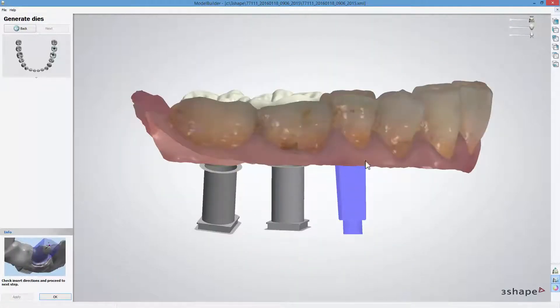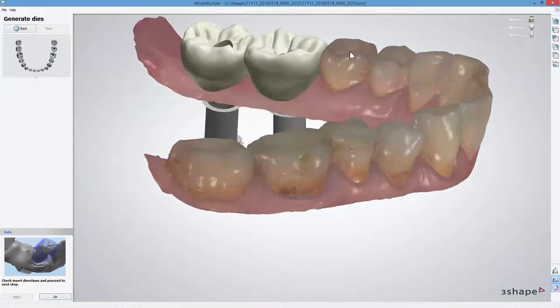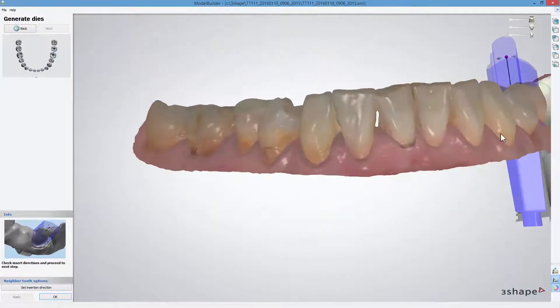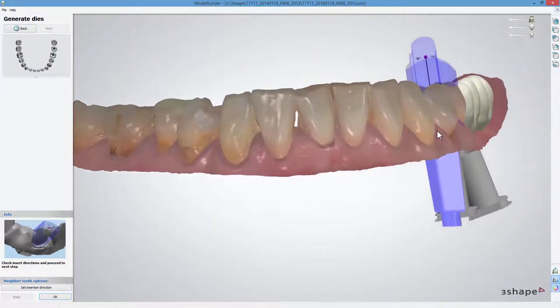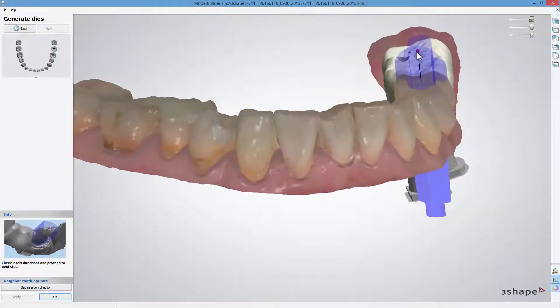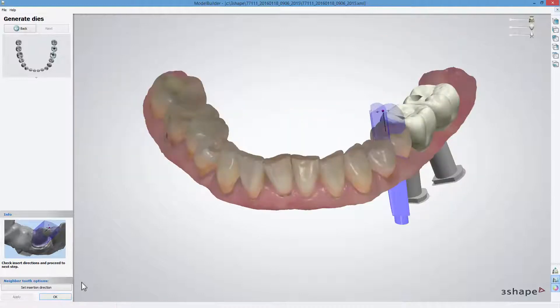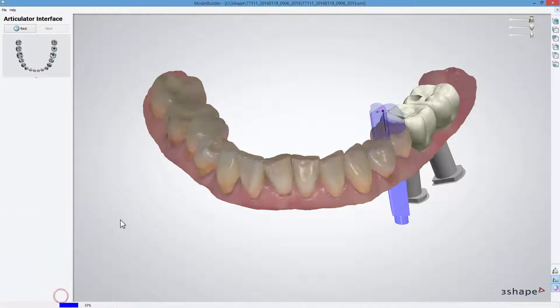In Generate Dies, you can modify the insertion direction by selecting a tooth with a mouse click and manipulating the control point. Click OK to go to the next step.